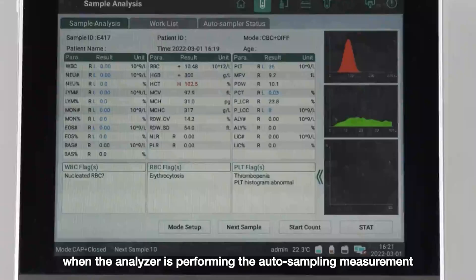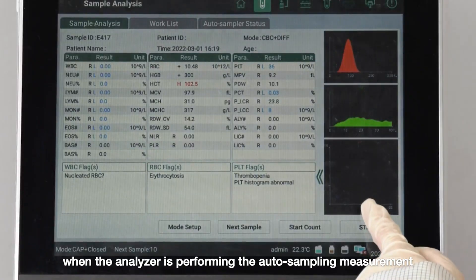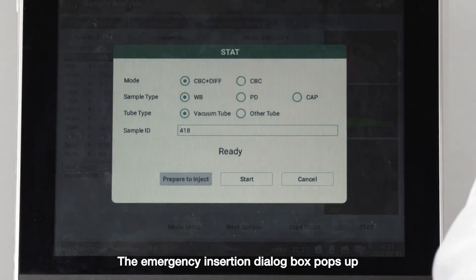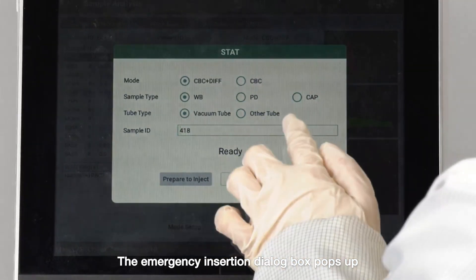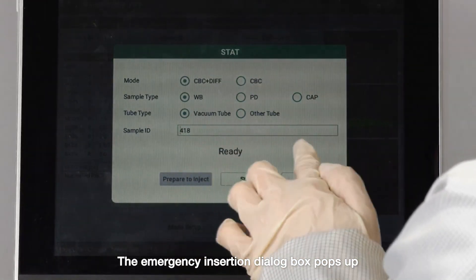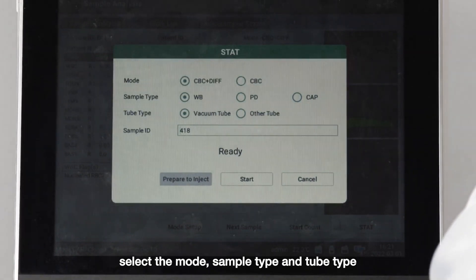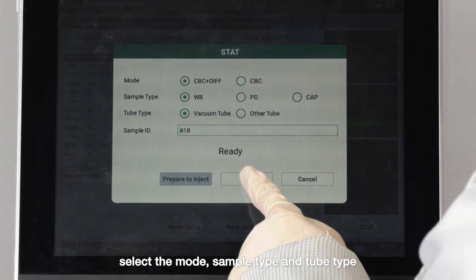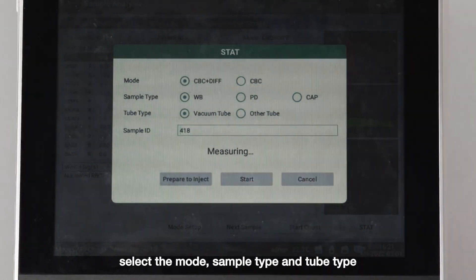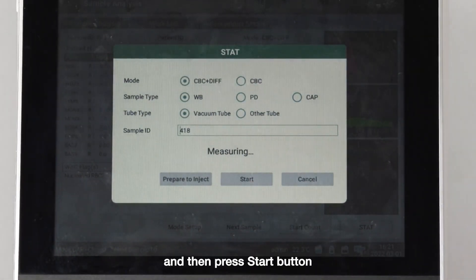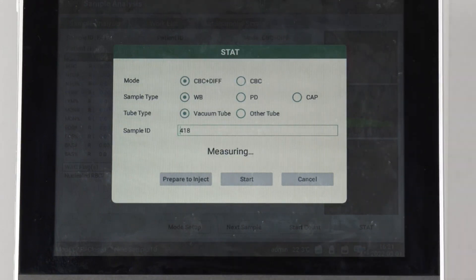When the analyzer is performing the auto sampling measurement, press that button. The emergency insertion i-log box pops up. Select the mode, sample type, and tube type, enter the sample ID, and then press the start button.